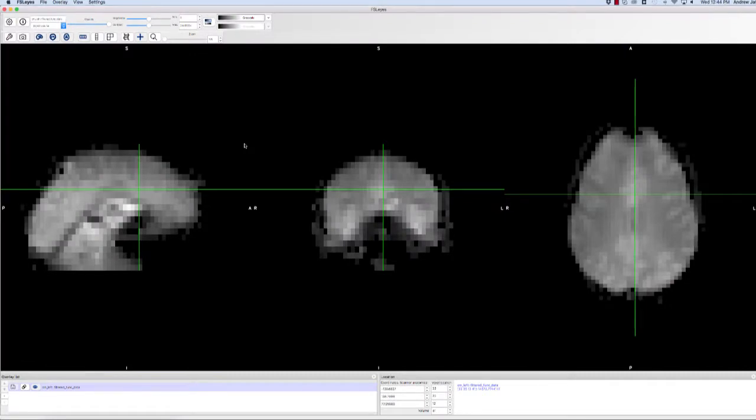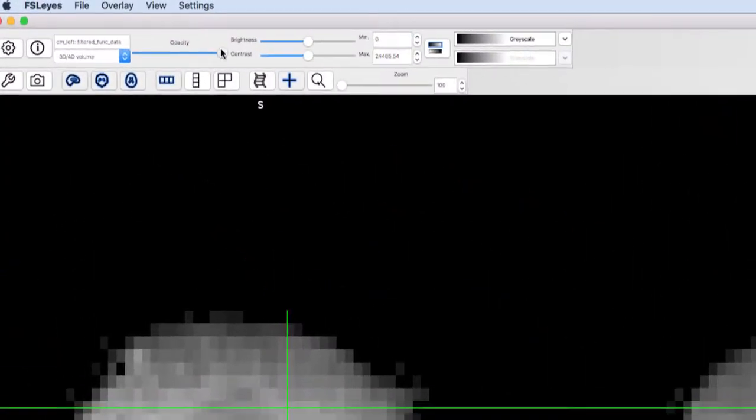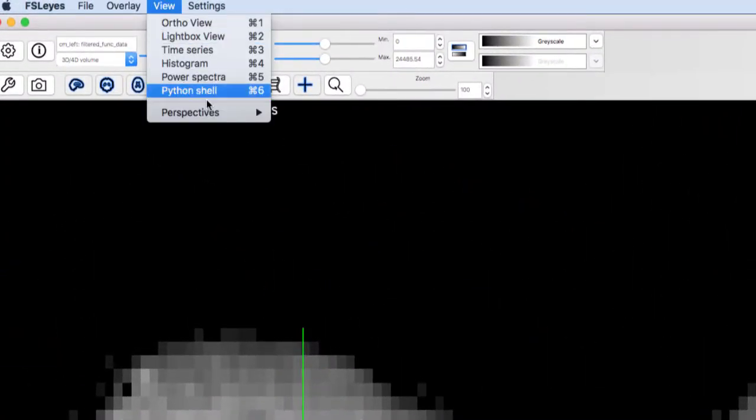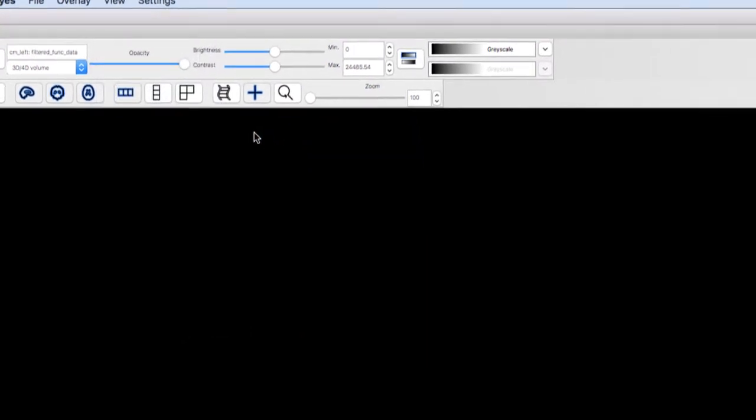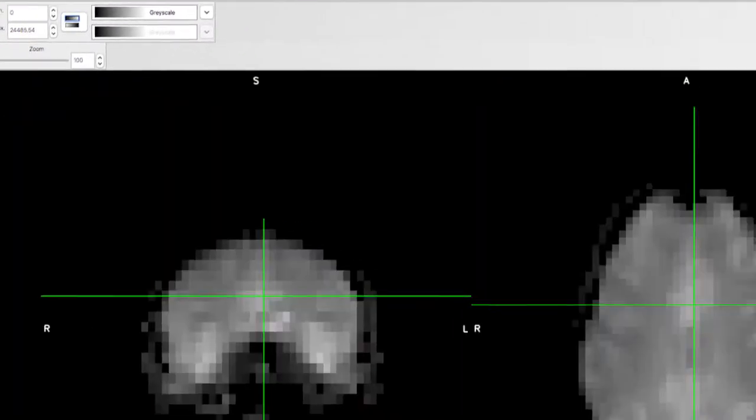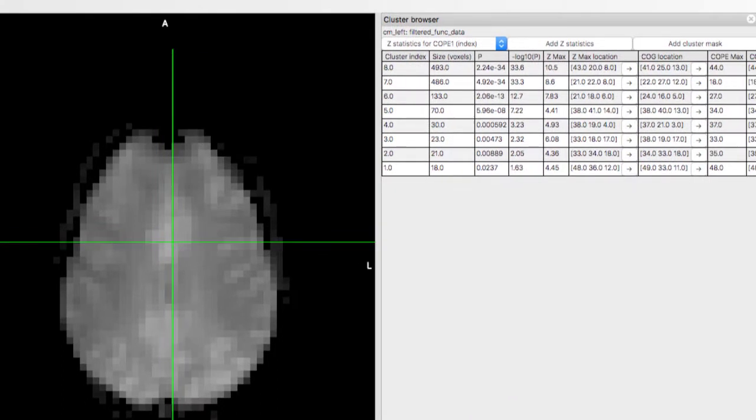Starting with our filtered func data, click on View, then Perspectives, and then Feat Mode. This will open up the time series panel, as well as a cluster browser showing the coordinates of peak activation for different clusters in that contrast.